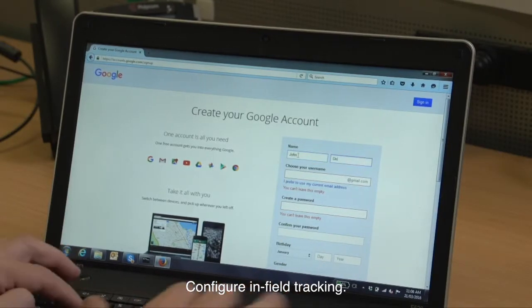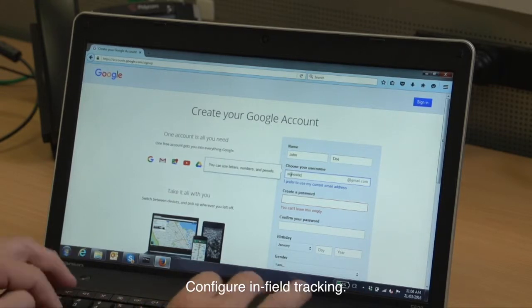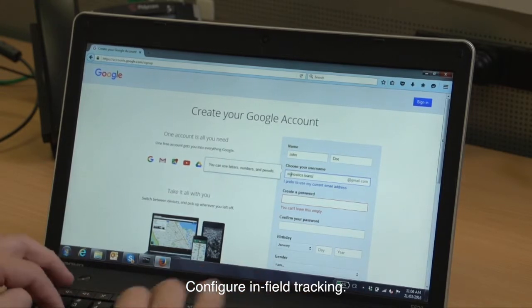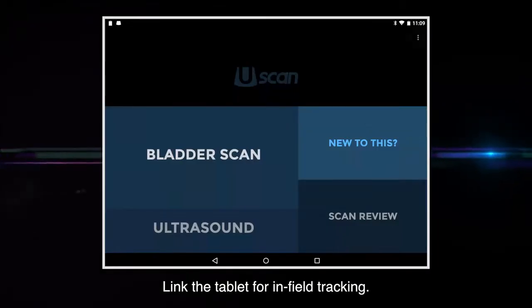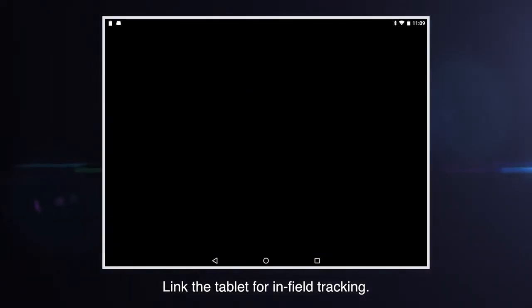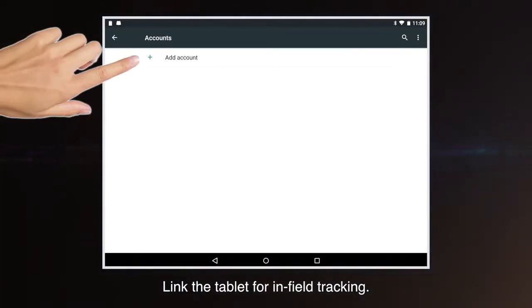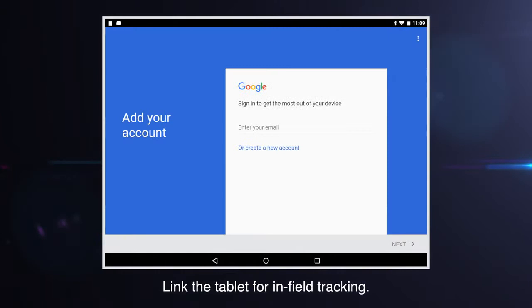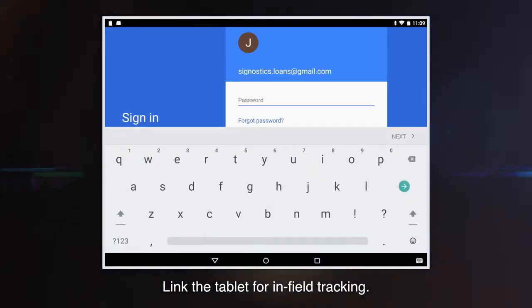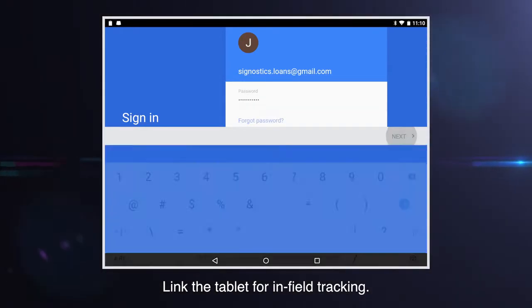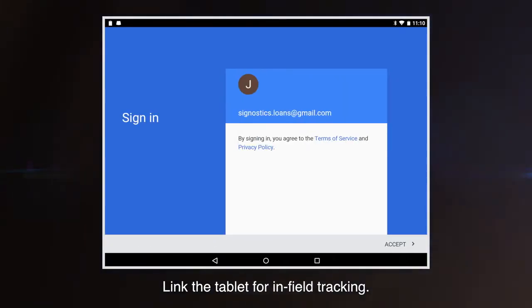Administrators can configure the systems they control to enable tracking in the field. The simplest way is to create a single Google account to manage and track all of the devices you own. Then link the account to the tablet using the system settings and accounts option. Tap add account, select Google, and enter the Google email. Sign in with the account password. There is no need to include payment information. Make sure location services are enabled.